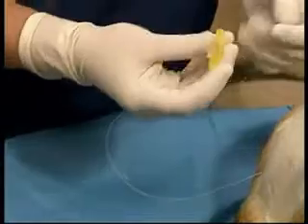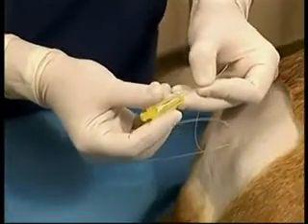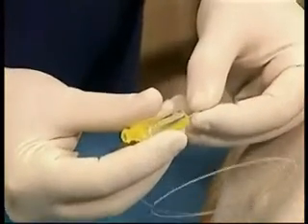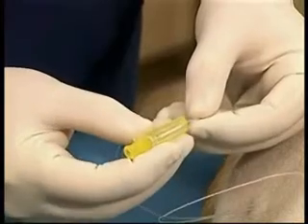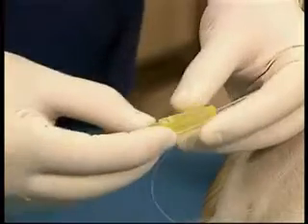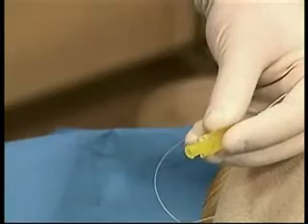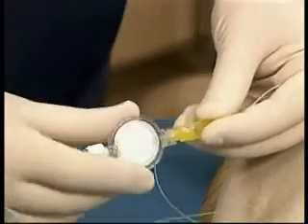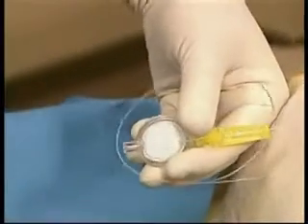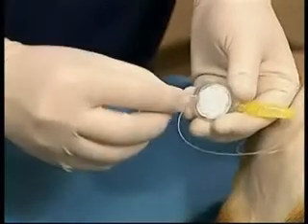The catheter is inserted into the specially designed Luer adapter, and then it is snapped down to secure the catheter in place. A filter is attached to the Luer, and at this point in time, injections can be given.